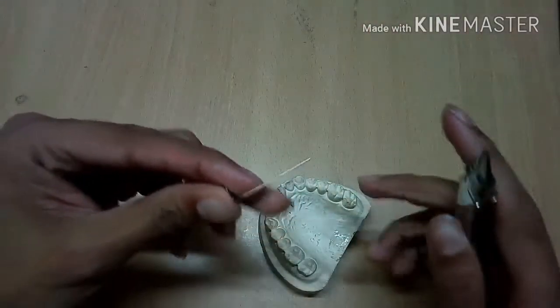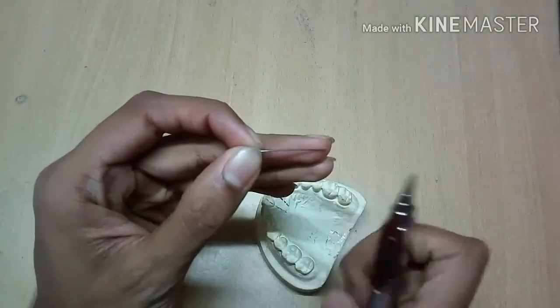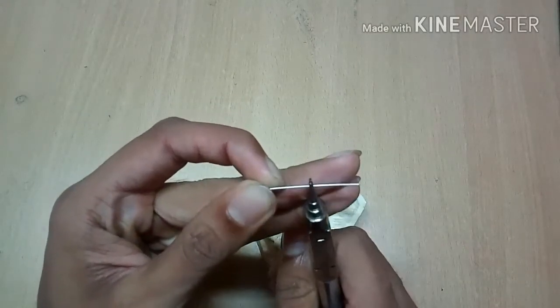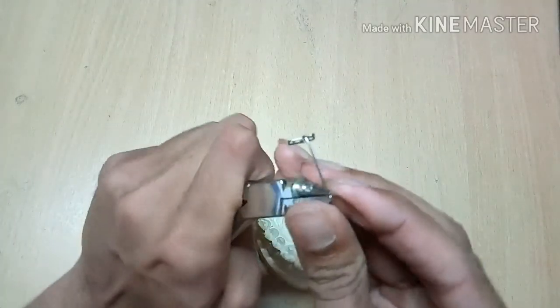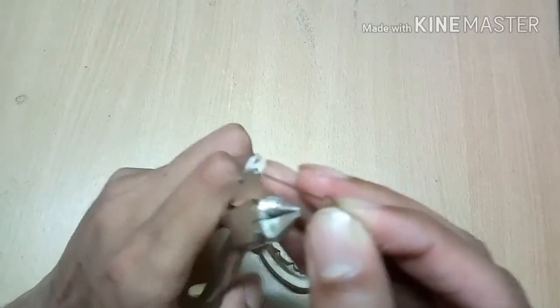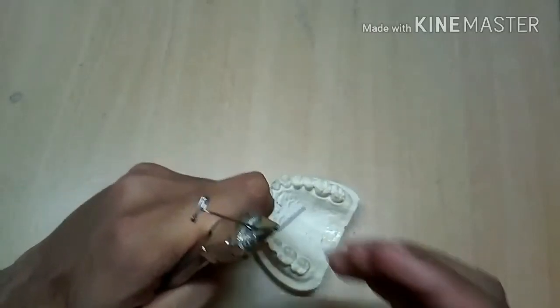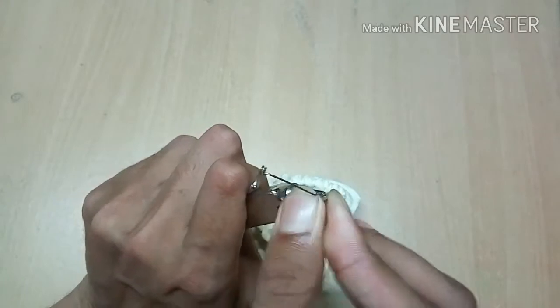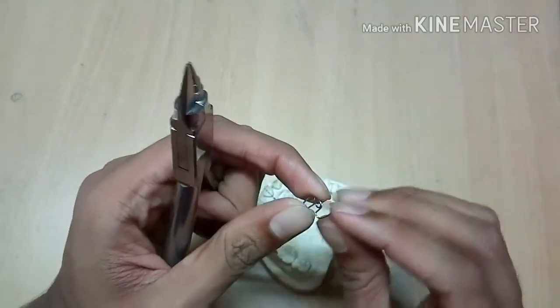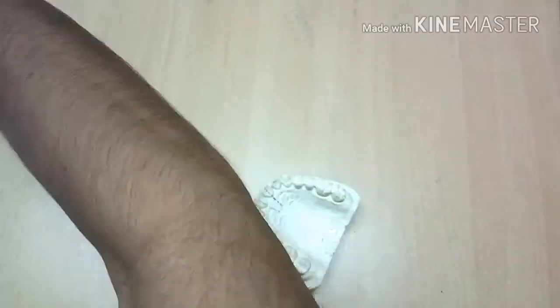Now it's time to make the retentive arm. Make the first bend, second bend, and so on. Cut the excess wire, then it's time to adapt.